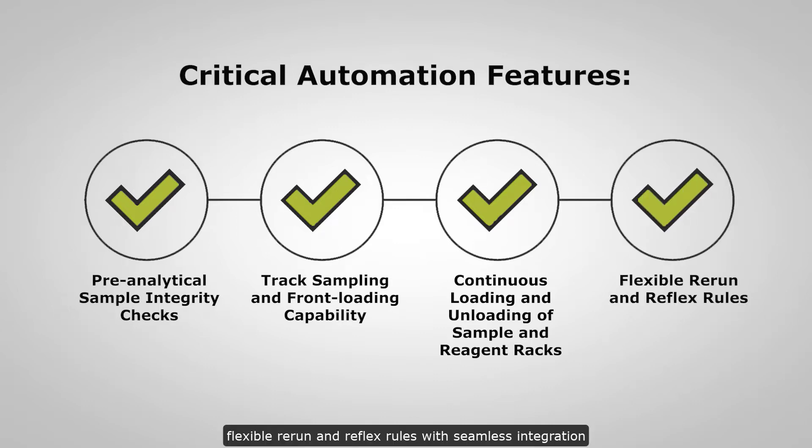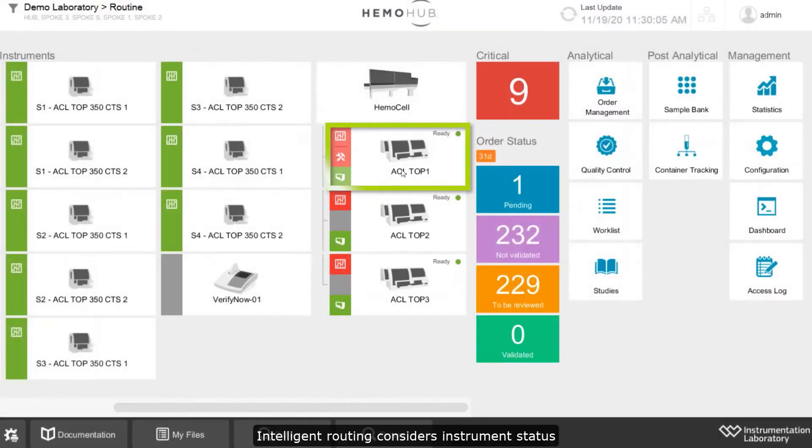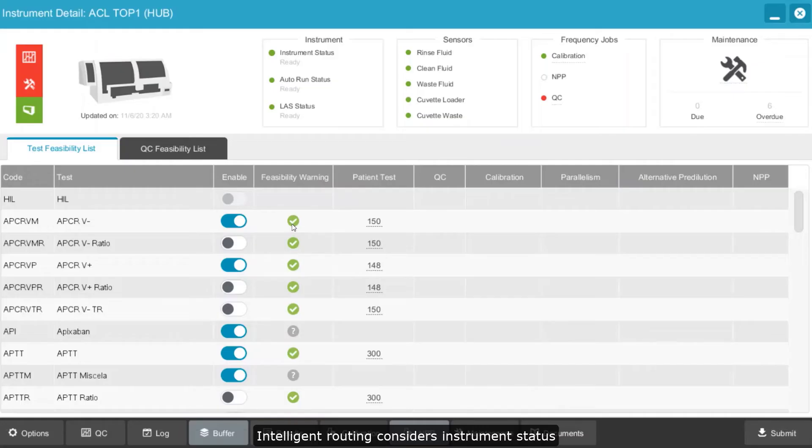Flexible rerun and reflex rules with seamless integration to Hemohub Intelligent Data Manager. Intelligent routing considers instrument status and test feasibility for all connected analyzers, allowing flexibility in daily operation.